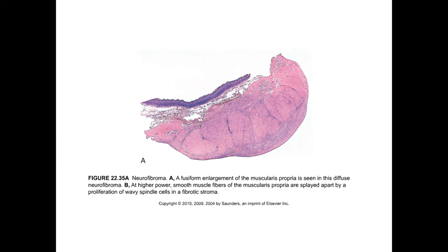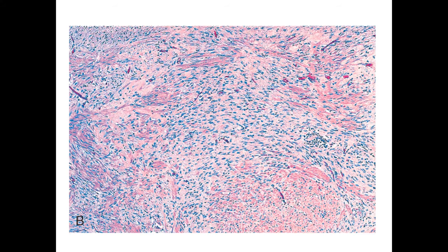Here's a nice example from the textbook showing the morphology and location of neurofibroma. Note that this is really a wall-based lesion rather than mucosal, which is expected because that's where the nerves tend to live. Higher magnification shows a very typical spindle cell morphology that interlaces between the smooth muscle. This can have the appearance of a malignancy; however, the cytology tends to be very bland and the mitotic rate would be low. Of concern is the fact that these lesions can give rise to malignant peripheral nerve sheath tumors as a possibility.